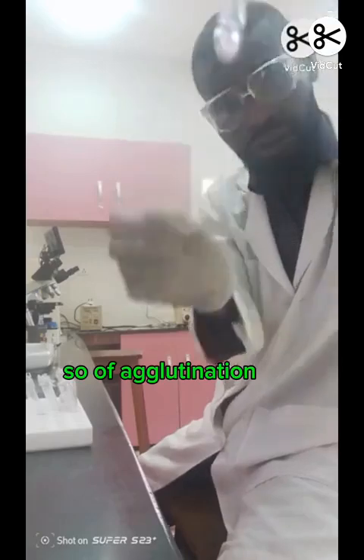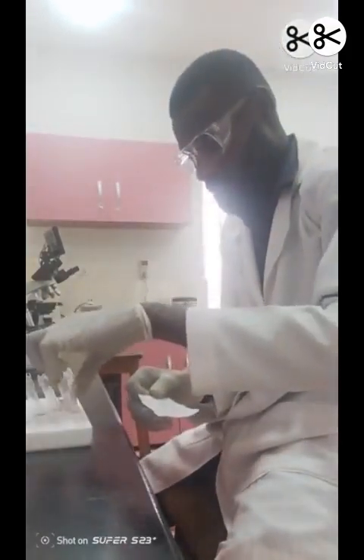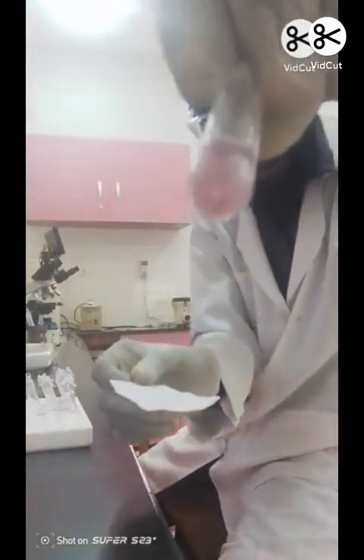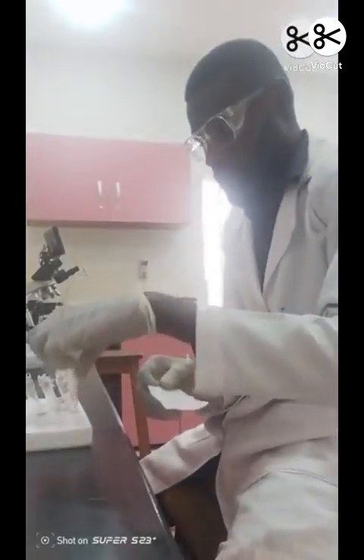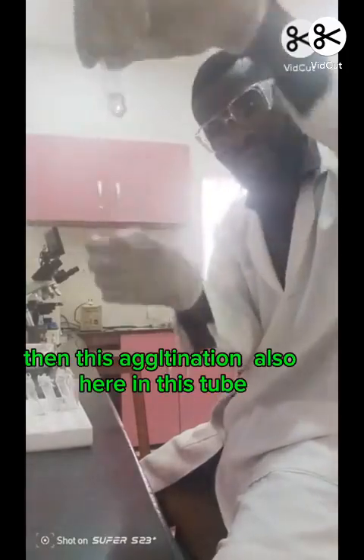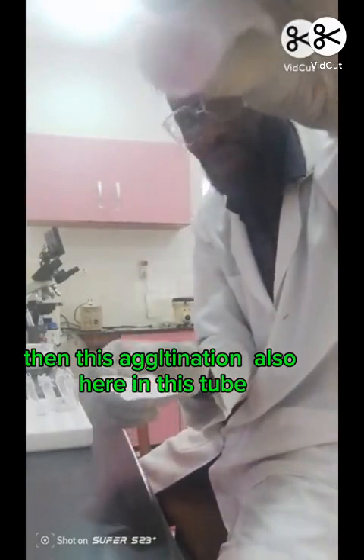So we have agglutination there. And you have this agglutination. Then there's agglutination also here in this tube.